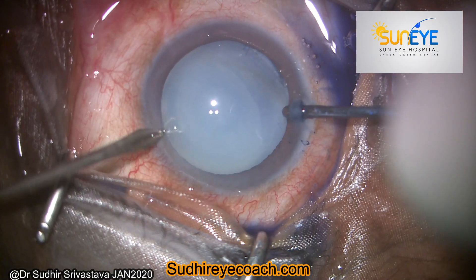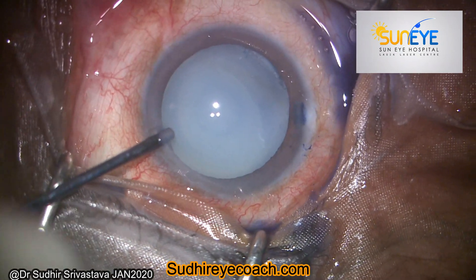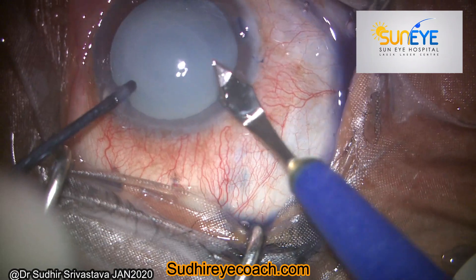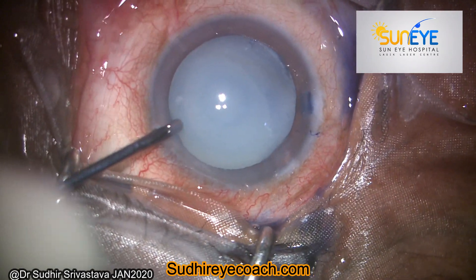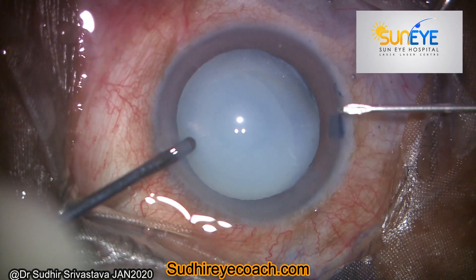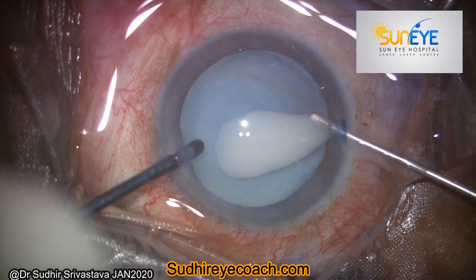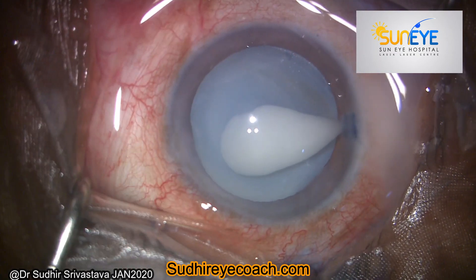Prepare your second side port. Whenever I deal with any kind of hypermature cataract, whether it's a Morgagnian cataract or an intumescent cataract, I always make my main port in position before starting my capsular access.